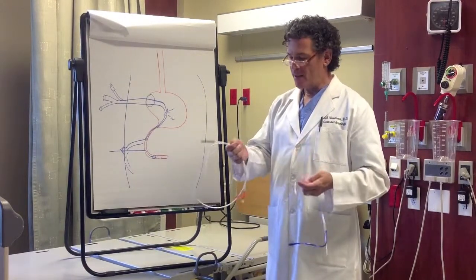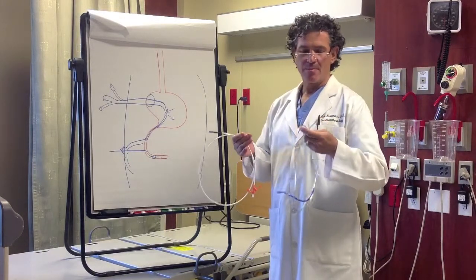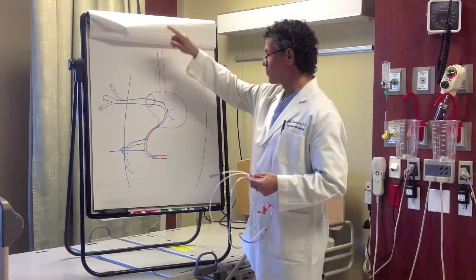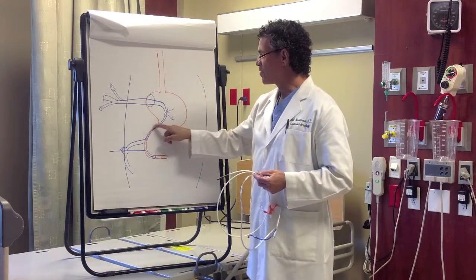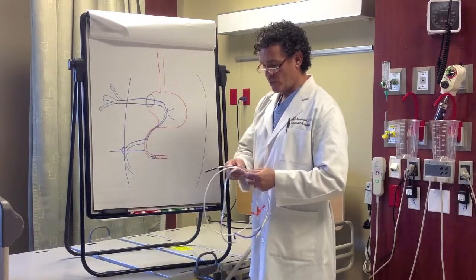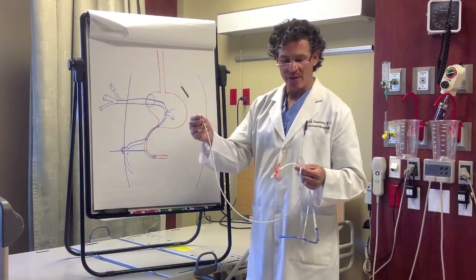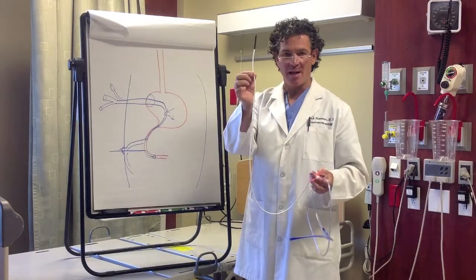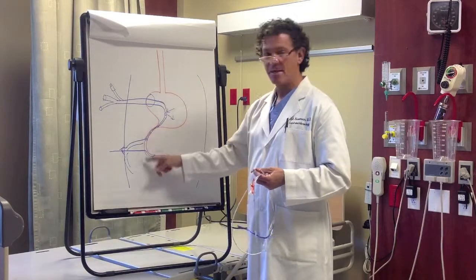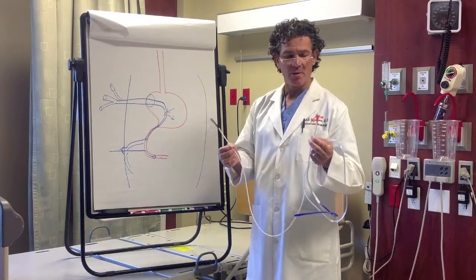So I want to talk about a small bowel nasal feeding tube and a gastric nasal feeding tube. The primary difference between the two, obviously, is that the small bowel feeding tube is designed to go through the nose, into the esophagus, into the stomach, and through the exit door of the stomach, known as the pylorus, down into the small intestine. We call these small bowel feeding tubes, or Dobhoff tubes, jejunal feeding tubes, duodenal feeding tubes. They tend to be smaller in caliper, so they clog a lot easier. They're more difficult to place because it's got to get out of the stomach into the small intestine. They're more comfortable. They tend to be more flexible.